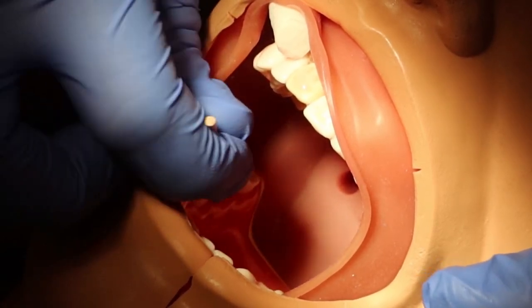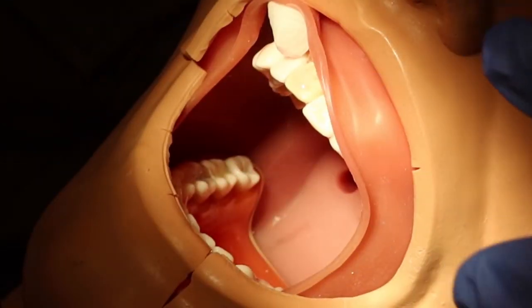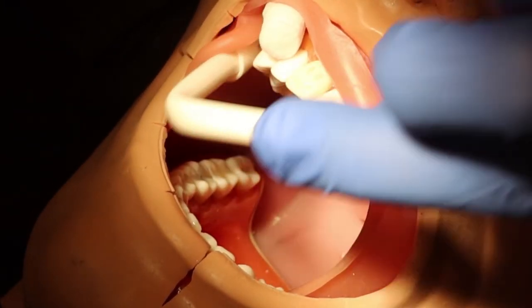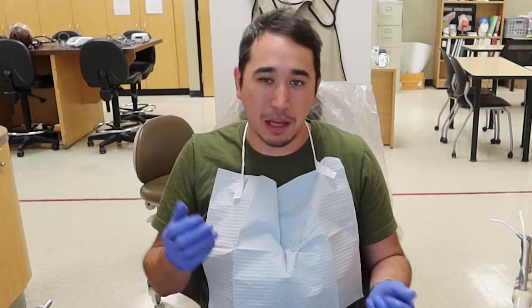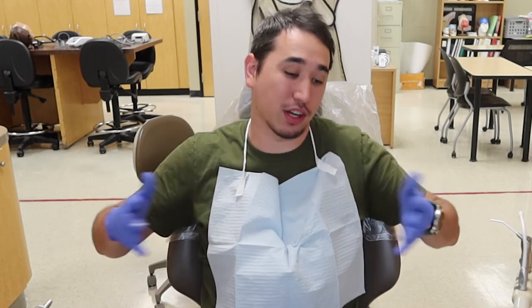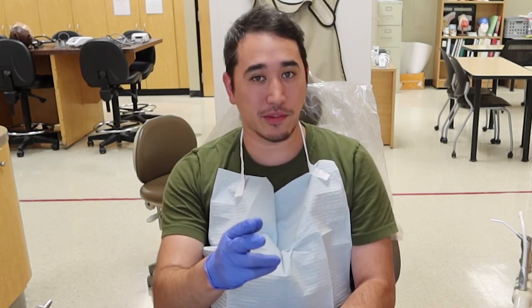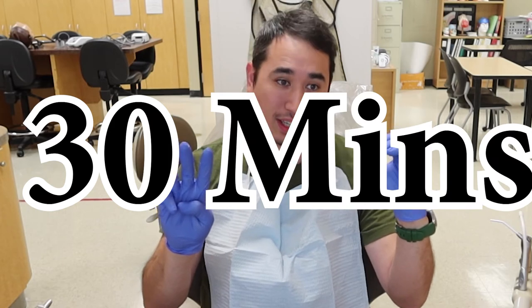Just talk and distract your patient for that next little bit while this does its awesome job. Once you get the majority wiped off, you can take your saliva ejector and hit those different little areas. Don't forget that we don't leave little presents behind — take those cotton rolls out. Typically, since this coincides with people getting their teeth coronally polished, we pretty much just brushed their teeth extra good, so they can probably skip tonight's brushing and wait till tomorrow. Make sure they remember they're going to need to wait a whole 30 minutes before they can eat or drink.